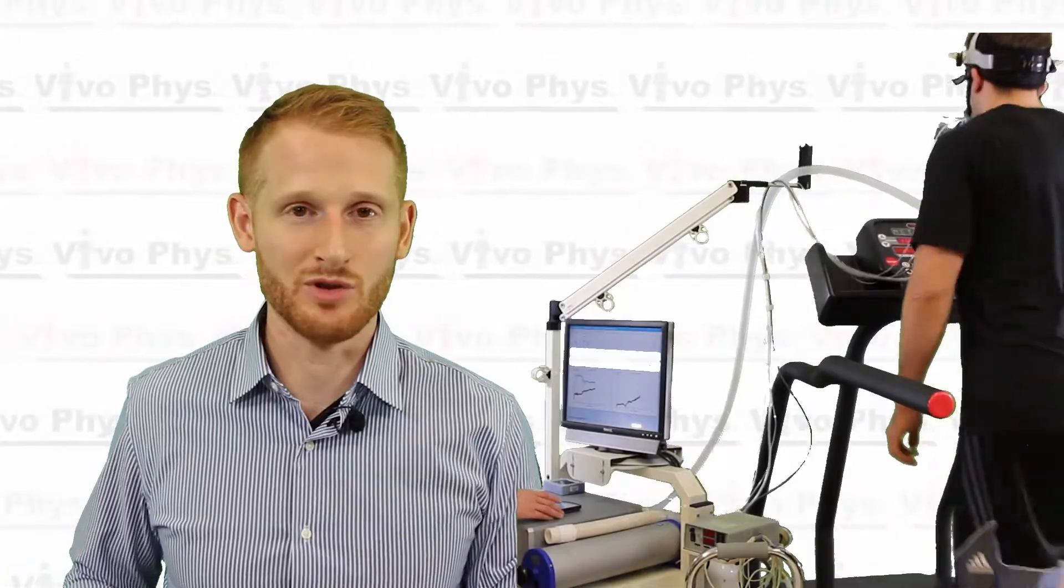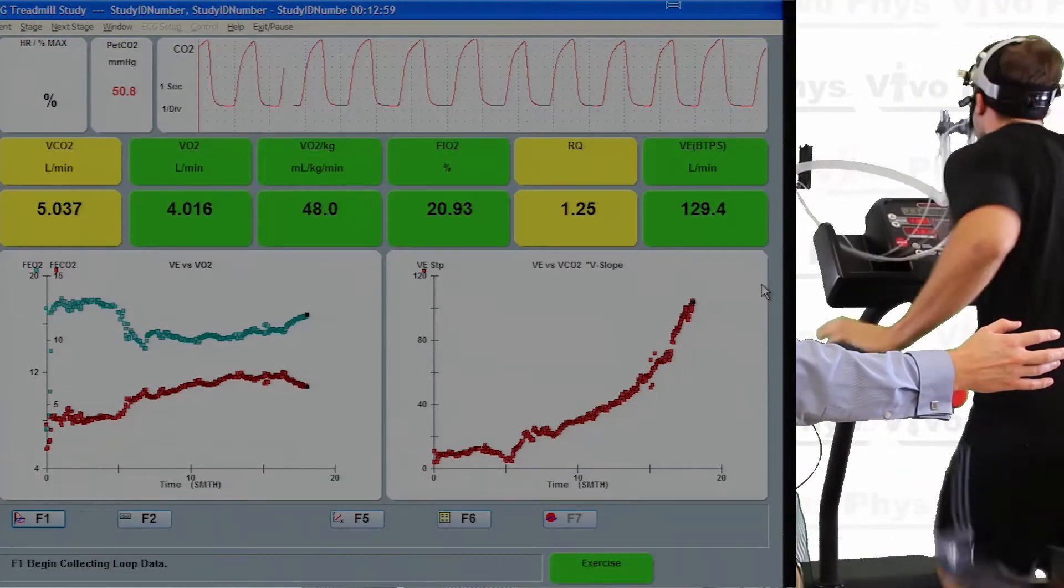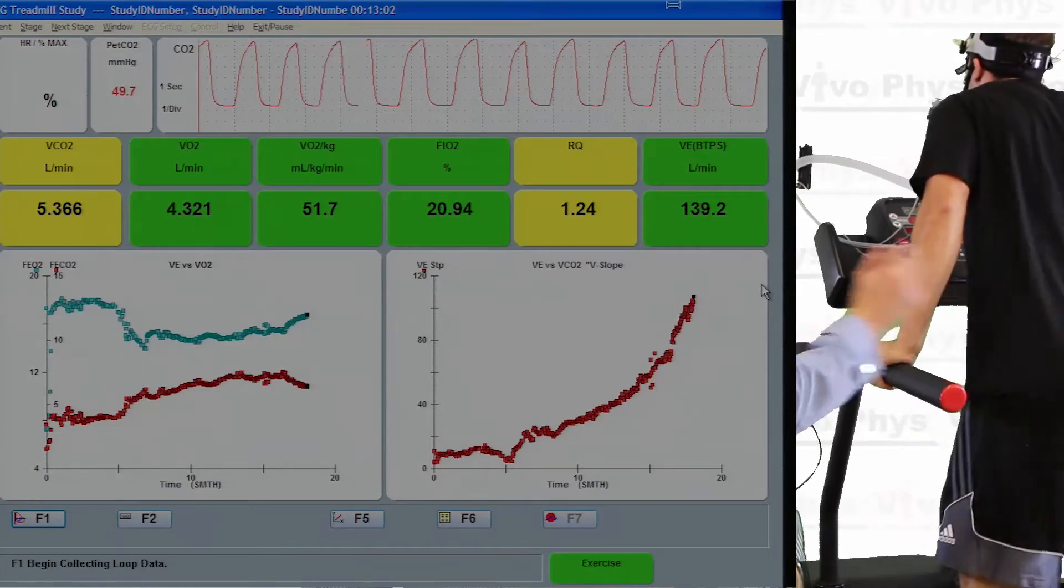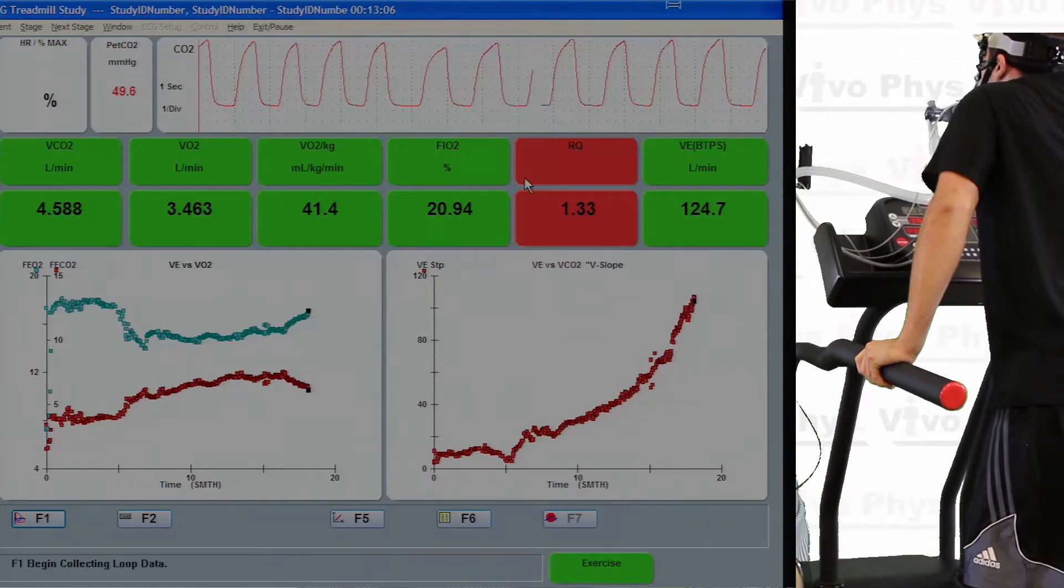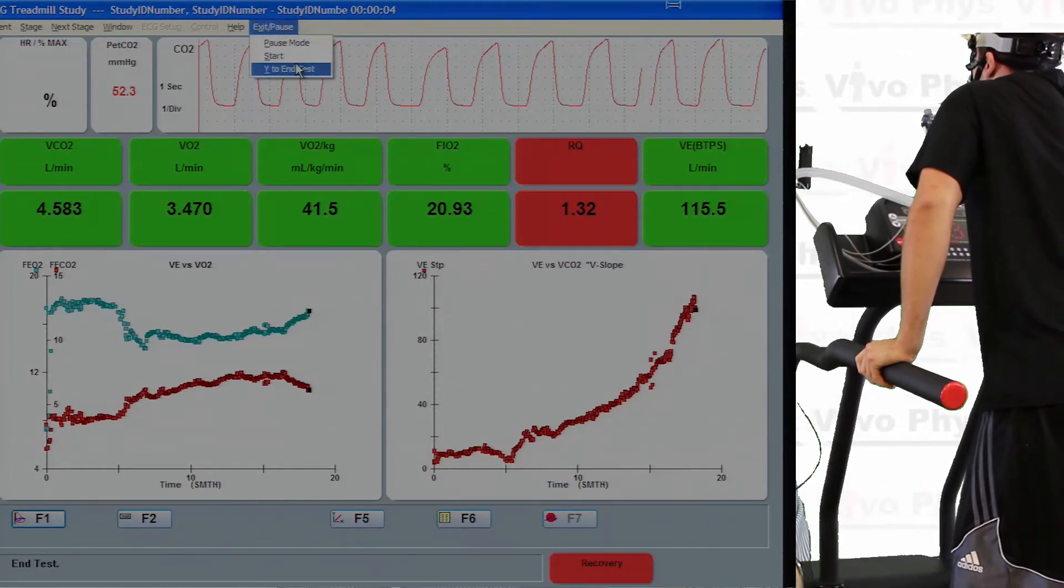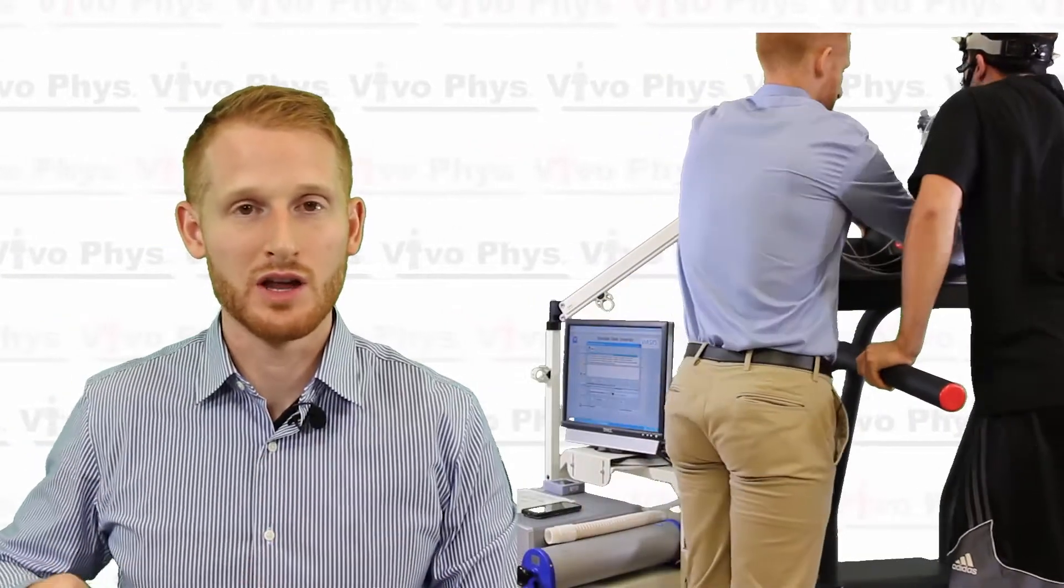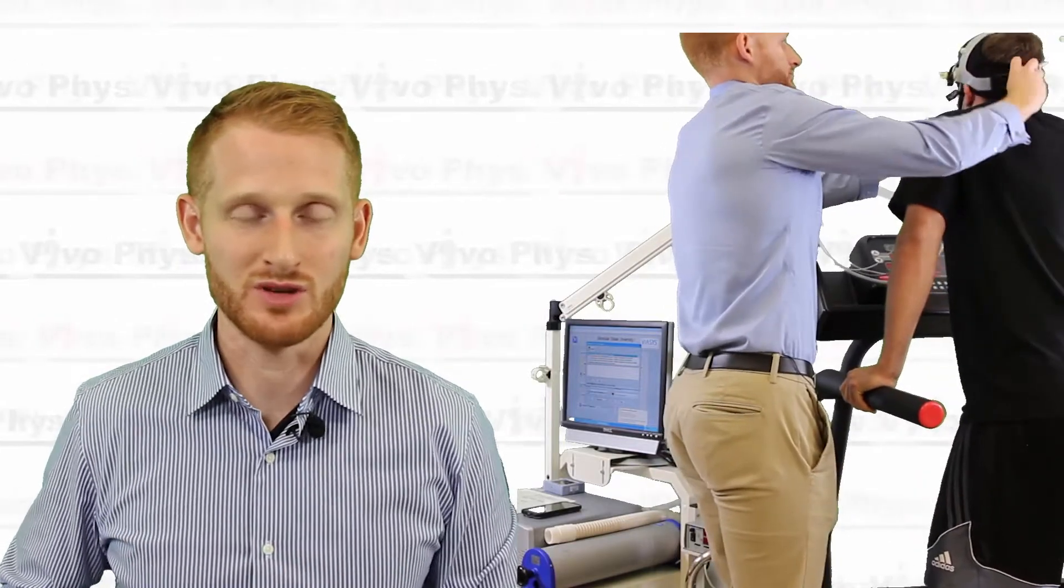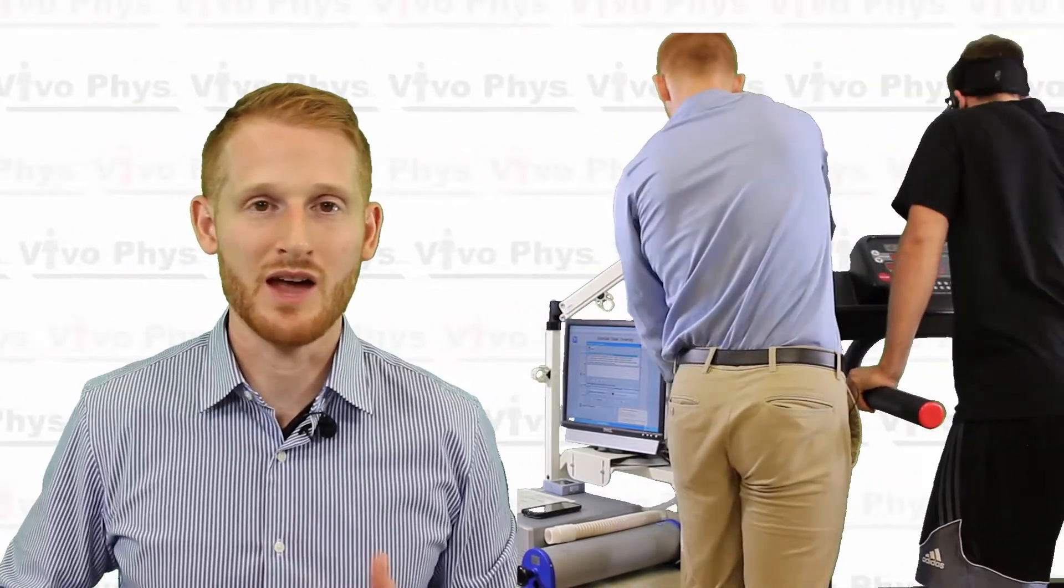When the person stops, as long as you're not planning on recording any recovery data, you're going to go to the menus across the top of the screen and go to the one that says exit and pause. Once you click on that, it's going to bring up a drop-down menu. Click on the one that says end test. Get the headgear off them, lower the treadmill to a lower speed and lower grade, and have the person do some recovery walking just so they can keep their blood flowing and not have any blood pooling in their legs. It'll help them feel better faster.